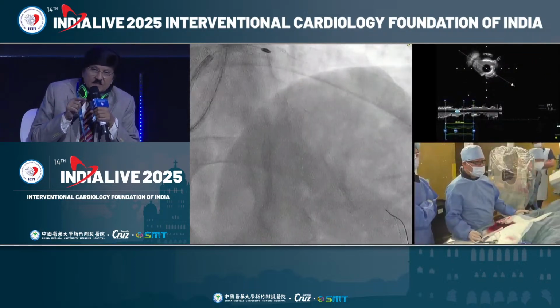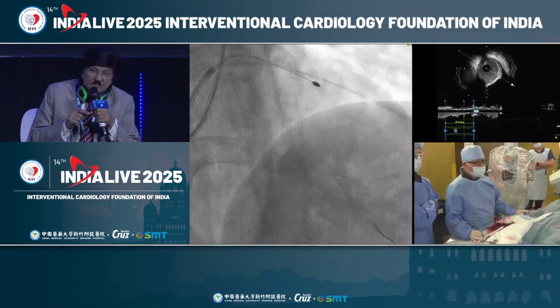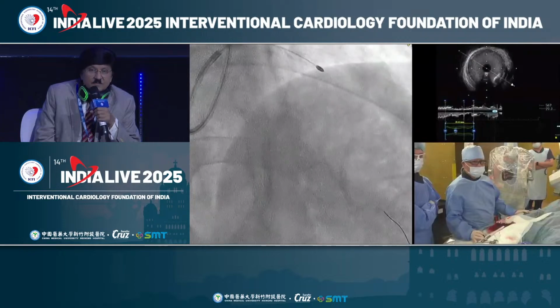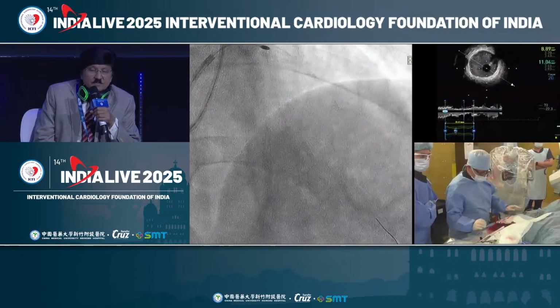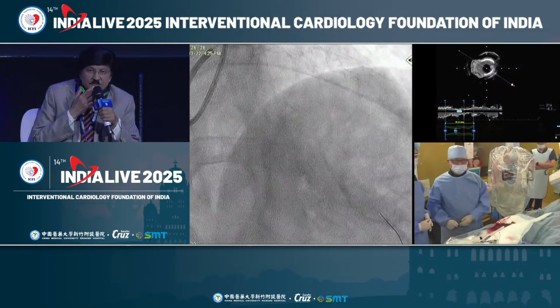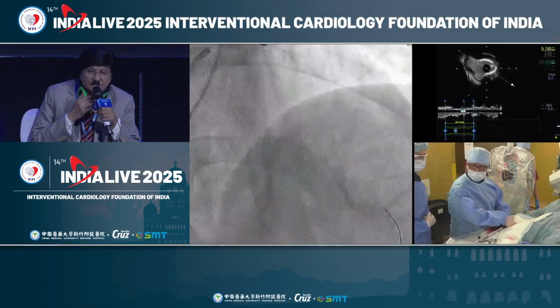Oh, no. This is not nodular calcium. If you can show the IVUS picture on the big screen, you can see continuously that the guide wire bias is from 0 to 3 o'clock. Yes, that's good. Thank you very much, Sensei. Thank you. So I already explained that.